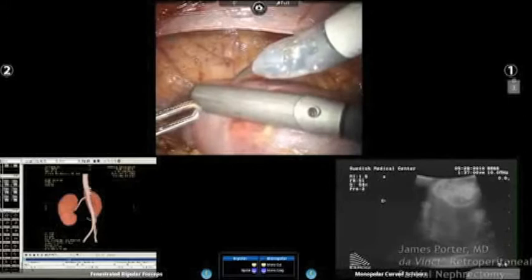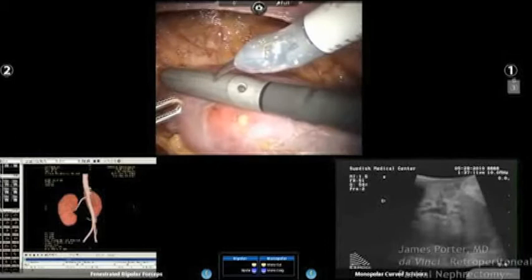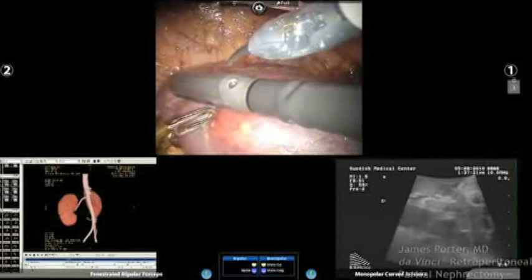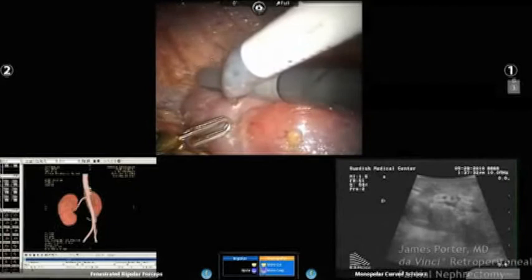So she's going to push all the way until we see, okay, pull back a little bit. Tumor's going away. Slow down, Nance. Slow down. Go push forward. Get to the edge of it. Right there. Stop. Slow down. Just stay right on top. We're just going to make our mark out here first. Push forward, please. Okay, right there. So you can see it's pretty wide, so we're going to make our mark out here. That's the edge of the black right there. I'm going to use that and make a mark out here.